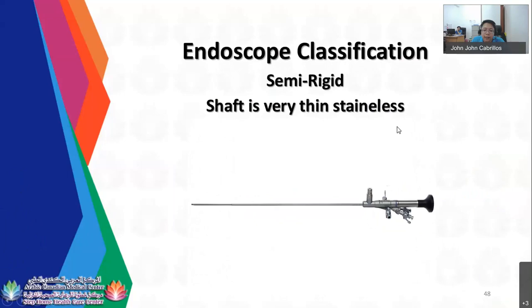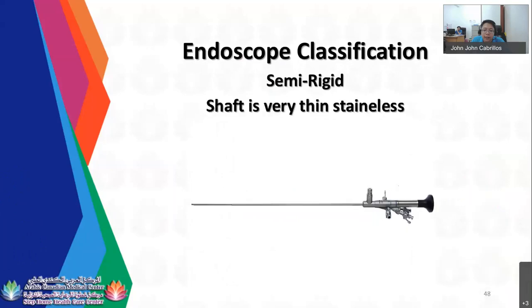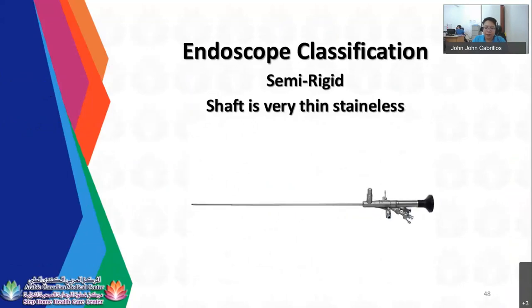So for your semi-rigid endoscope, the shaft is very thin. As you can see the difference, the shaft of your rigid endoscope is bigger and thicker, while the semi-rigid is smaller. For your semi-rigid endoscope, your shaft is very thin. They are all stainless. It is relatively straight line when going inside the body of your patient, and it requires a slight bending. It can slightly bend.